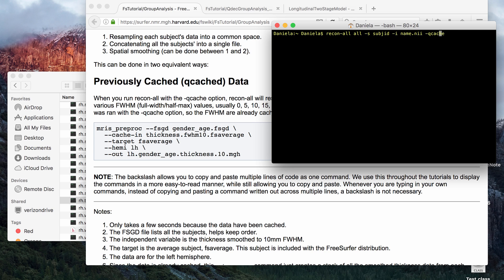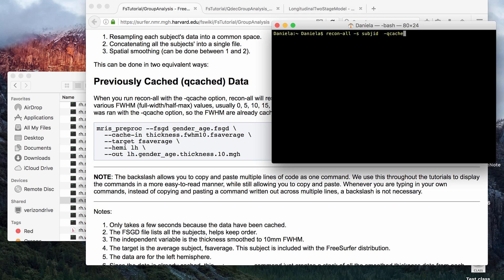Or if you already have a subject folder with the data preprocessed using recon-all, then you can still use the Qcache command and you run it like this: recon-all, the name of the subject from the subject folder, and then the Qcache command.